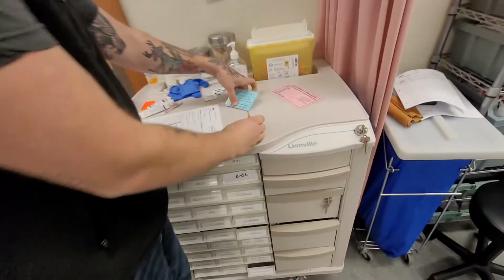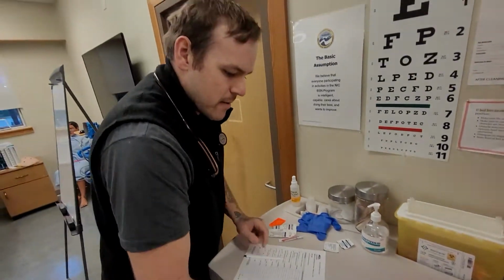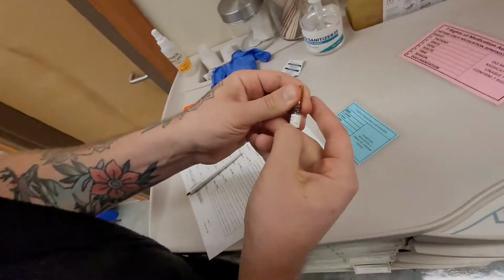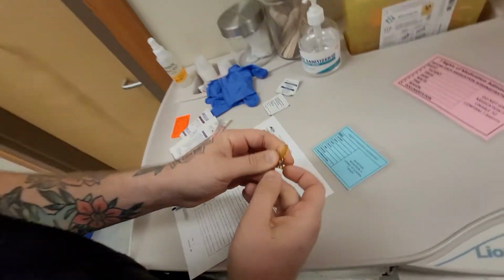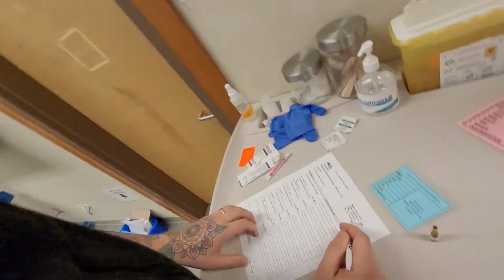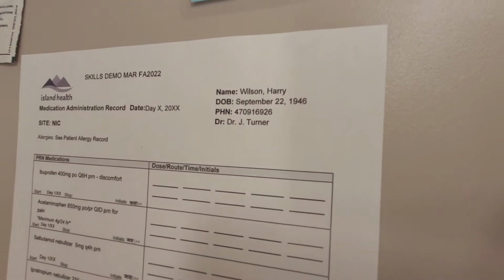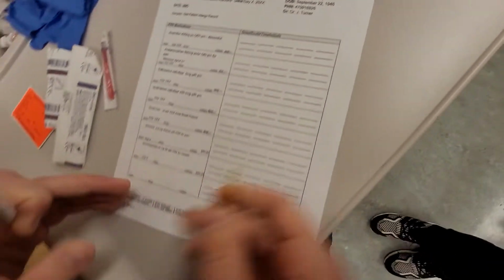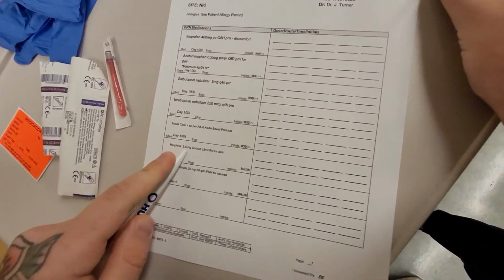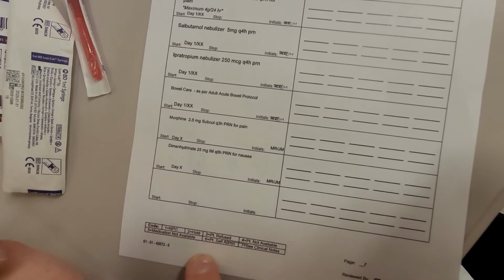Before that, we'll just go over our 7 rights. So this is morphine. It's not expired, 12/20/30. Right patient, we've got Mr. Harry Wilson here, who I'm going to be giving it to, and I'm going to confirm that at the bedside with the MAR. We've got the right drug, it's morphine. The right dose is 2.5 milligrams. We're going to draw that up, which will be 0.25 milliliters.